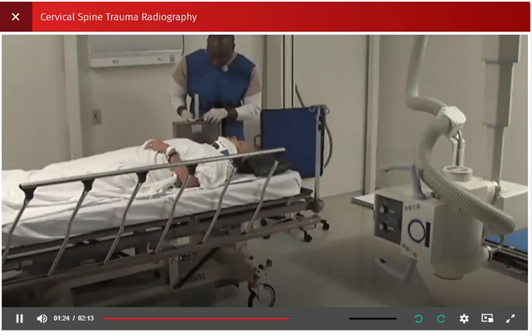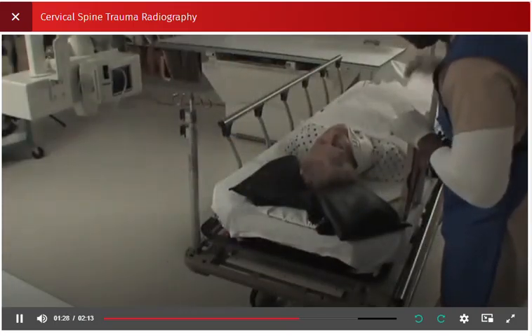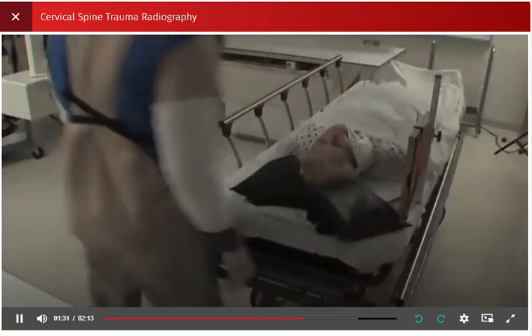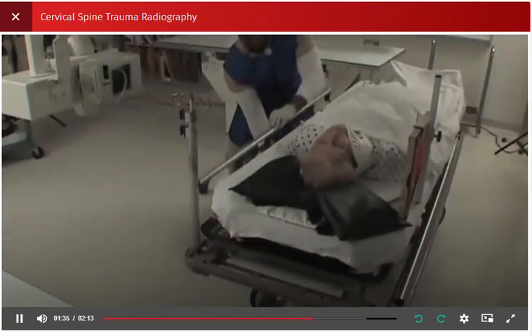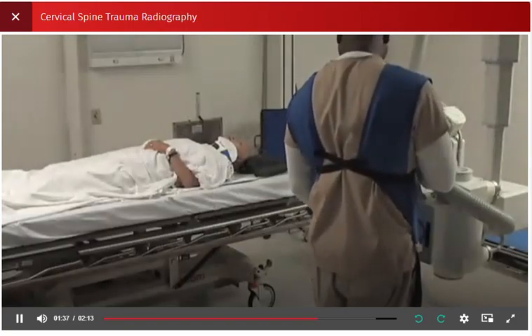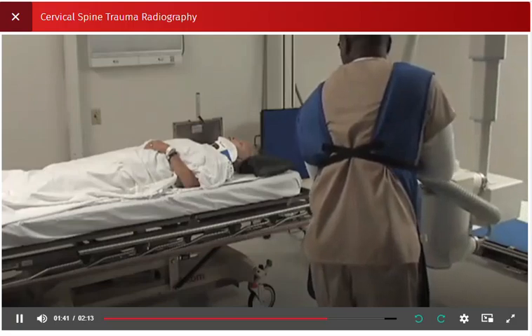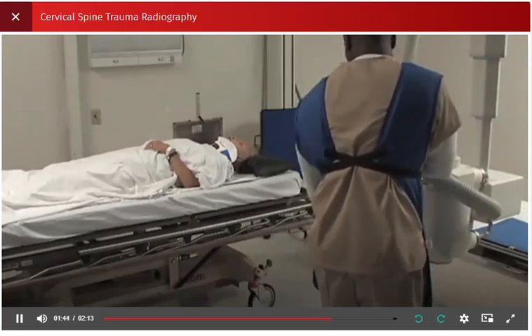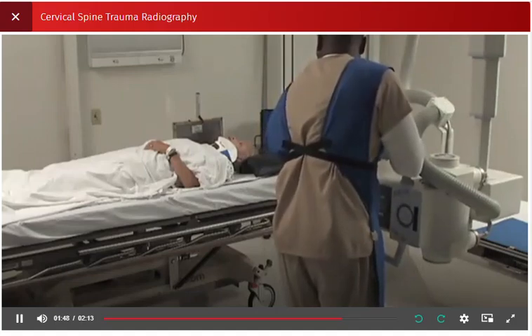Place the holder as close as possible to the patient's shoulder and center the IR 1 to 2 inches above the EAM. Ensure that the image receptor does not move or fall. Set up the X-ray equipment and turn the tube to obtain a horizontal beam directed perpendicular to the cervical spine. Collimate on all sides to the neck tissue borders to include the anatomy of interest and to decrease patient dose.